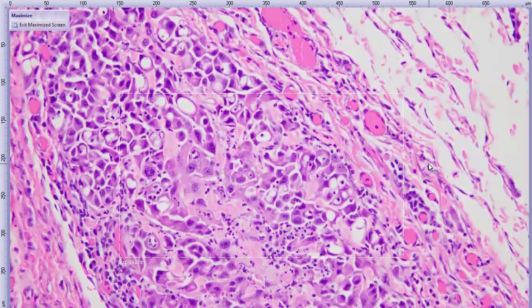It implies that these cells are secreting something, maybe mucin, hard to be sure just based on H&E alone. But the laundry list of potential primary locations that could produce cells with this sort of morphology is still pretty long. We could think of respiratory tumors, urothelial, gastrointestinal, et cetera. So in this case, the recommendation for this patient is full staging and a hunt for a primary neoplasm, because we assume that these cells did not arise locally. Unfortunate for such a young animal, a little less than 5 years old.